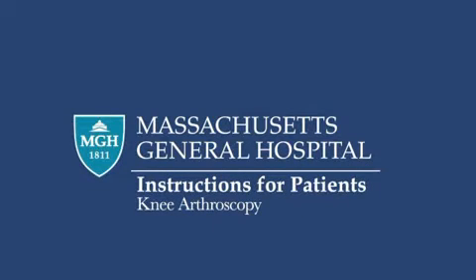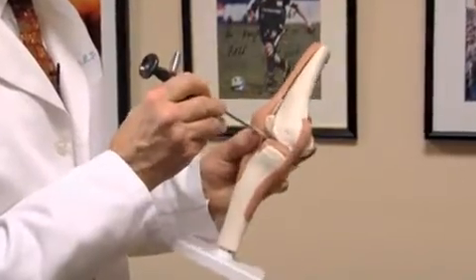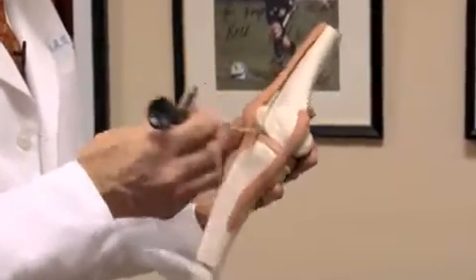The purpose of this video presentation is to inform you about arthroscopy and arthroscopic surgery, its benefits and risks and potential complications. You will now see a video that contains information you need to know for your knee arthroscopy. This is an arthroscope. It is an instrument that allows us to look directly into the knee joint.